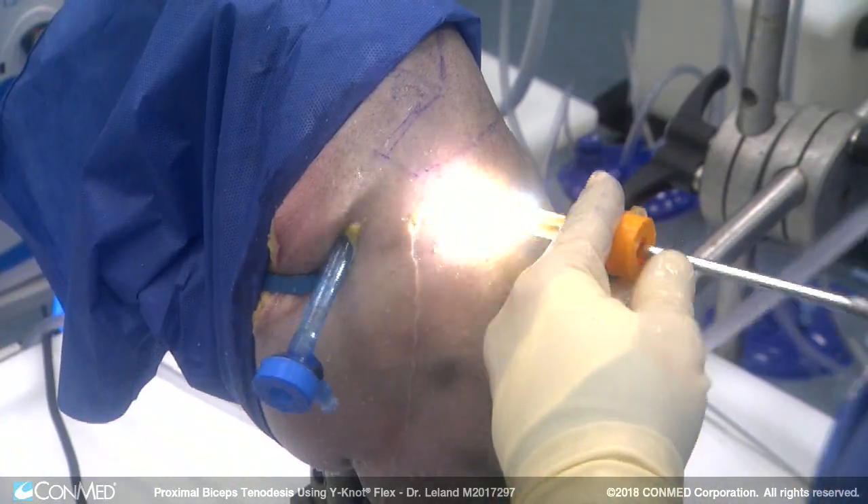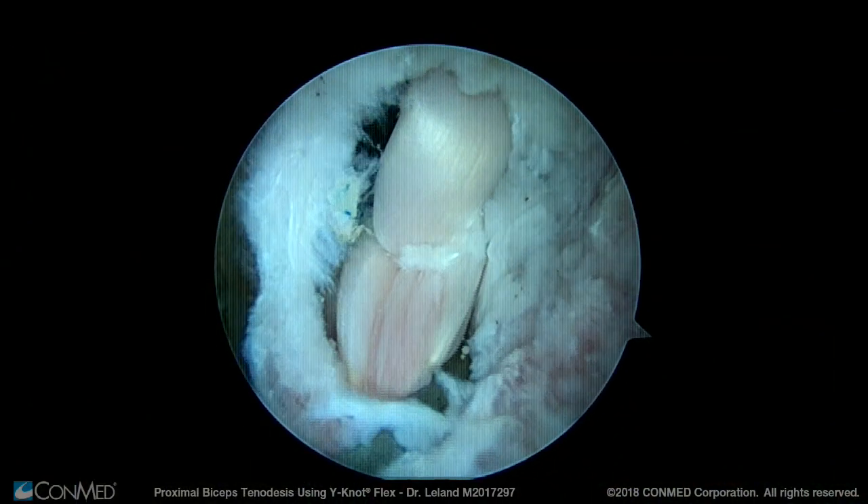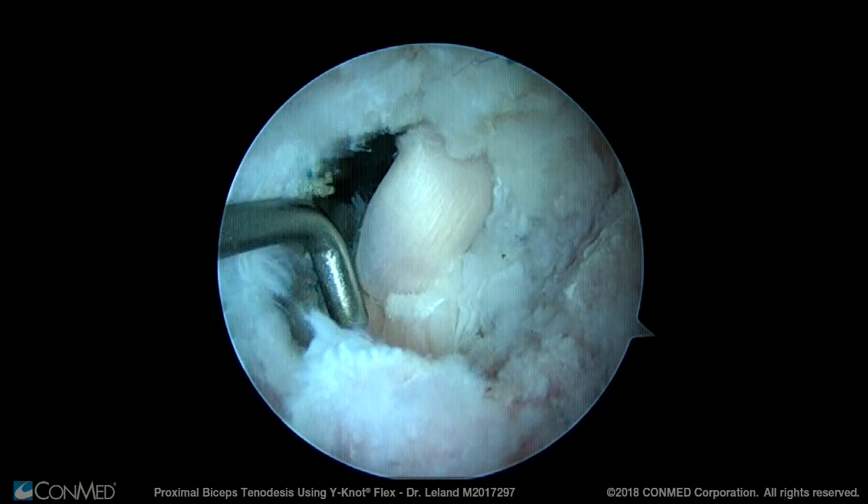By putting the scope into the subacromial space again, we can confirm excellent fixation on the biceps, which is held at its anatomic working length using the ConMed Y-Knot Flex. Thank you.